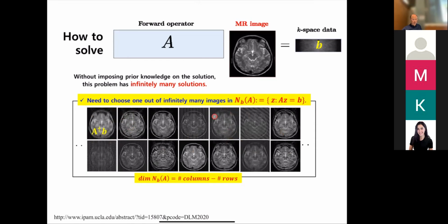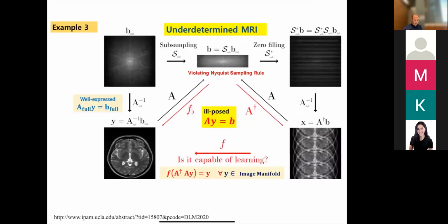So the job of my recon is how do I go from this universe of infinitely many solutions and pick the solution that's most consistent with what my training data sets do. So this is essentially, can I learn to go, and here's the case where we did the bad recon, can I actually let the deep learning network go from this directly to this? Okay, so that's one way of doing deep learning.